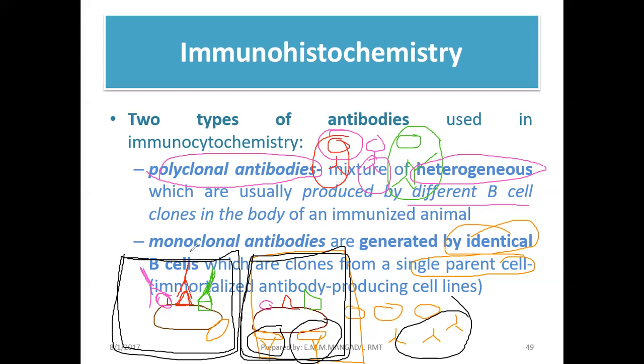So polyclonal. If you can see, the polyclonal antibodies are capable of binding the antigen but at different portions or at different types of epitopes. Depende kung saan sila directed or against. But in your monoclonal, dahil isa lang na klase ng population ang napoproduce natin, puro orange, ibig sabihin, yung binding mo, nasa orange epitope lang.